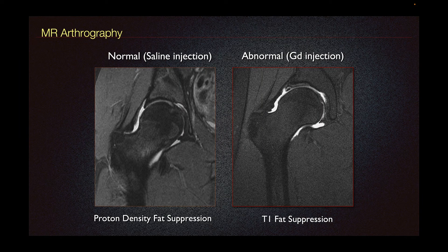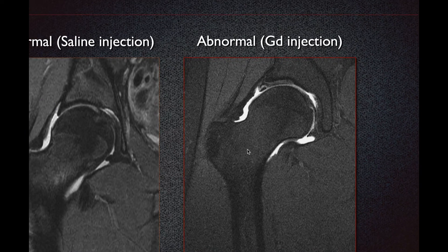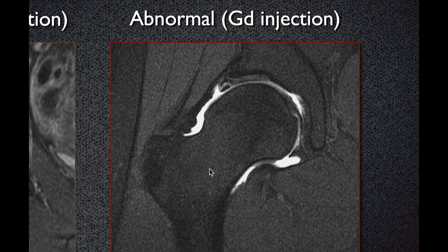If there is concern for labral pathology, MR arthrography can be performed for further evaluation. On the left-hand side, we can see a normal labrum showing a triangular hypointense band without signal abnormality within it. On the right-hand side, on T1 fat-suppressed imaging, we can see there is increased signal in the substance of the labrum consistent with a labral tear.